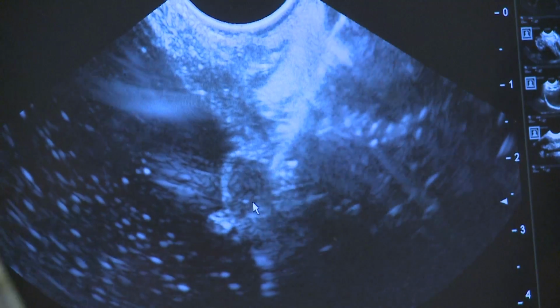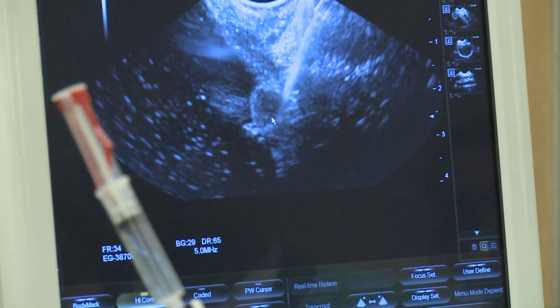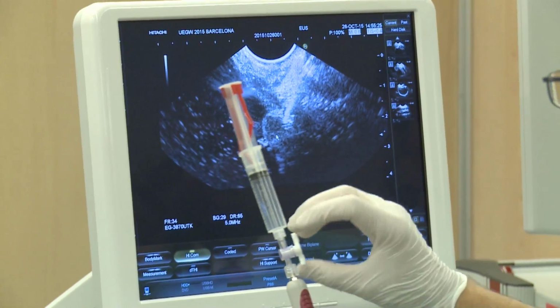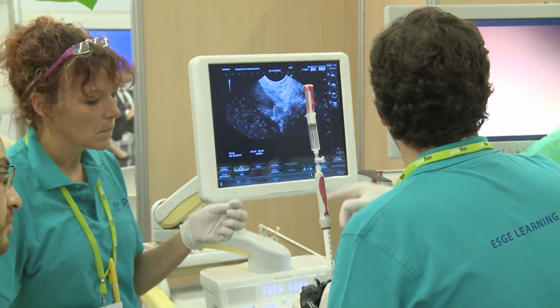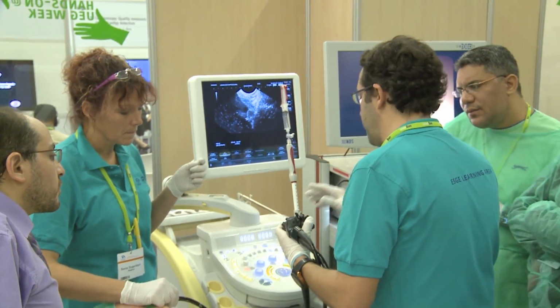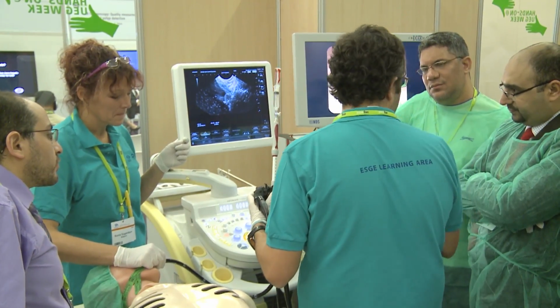So what you try to get is as much material as possible, okay? So this is a standard procedure. Sometimes we can just say, okay, this is okay for me, so I just stop suction. And now there is a theory. This is not the best needle, but this is a model, so we can discuss. Don't do this with the Procore, okay?